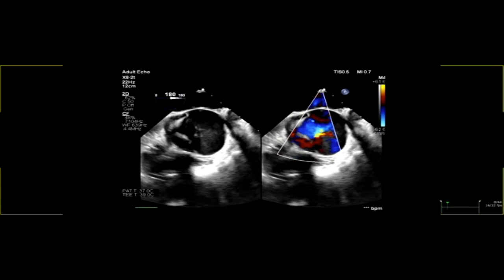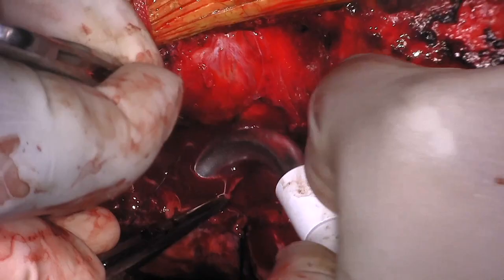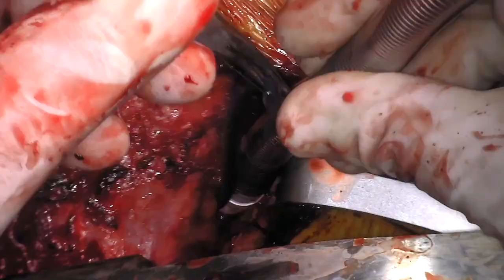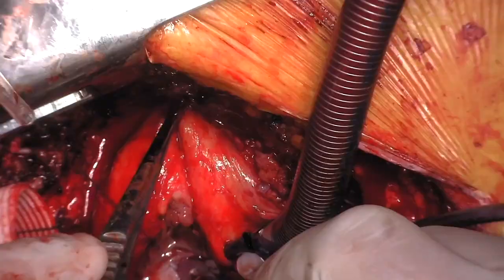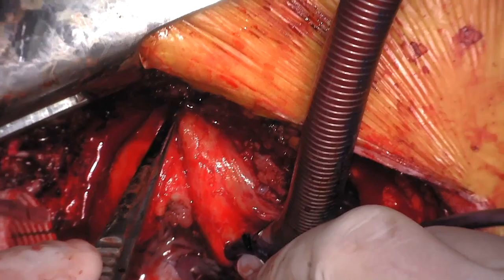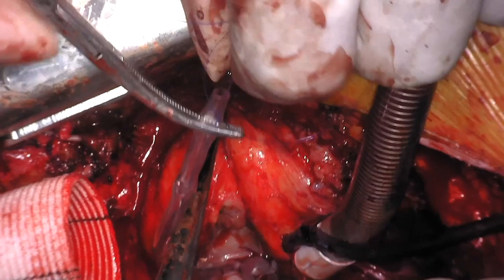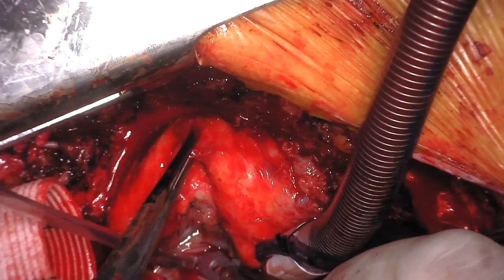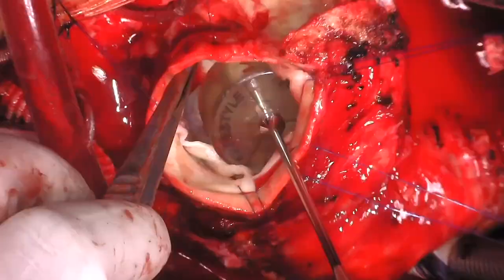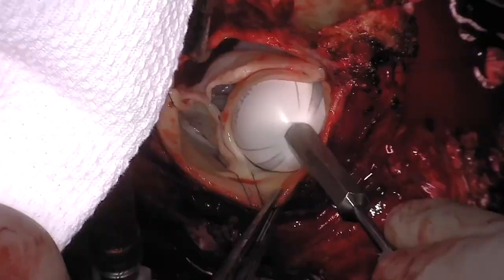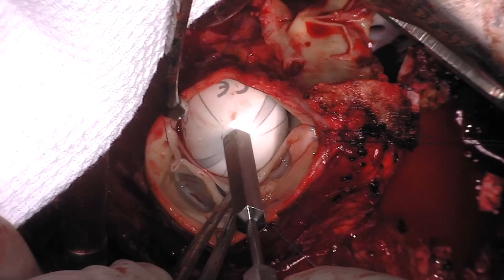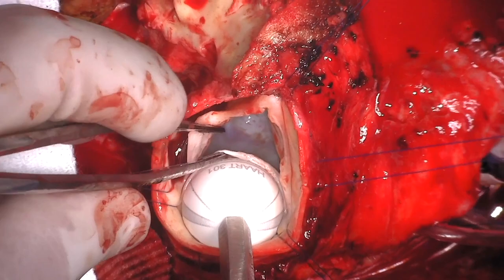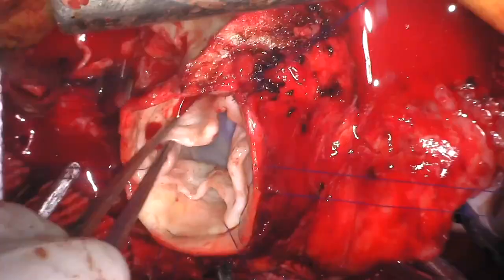Patient is placed on cardiopulmonary bypass using cannulation in the distal ascending aorta because of the aortic aneurysm. The aneurysm was replaced with a 28 mm Hemashield graft. Subsequent cardioplegia was given through the coronary sinus via a retrograde coronary sinus catheter sutured in place. Aortic valve is examined — it is significantly dilated, well beyond the 29 mm sizer. The 23 mm sizer fits the non-coronary sinus well, so a 23 mm ring will be used.